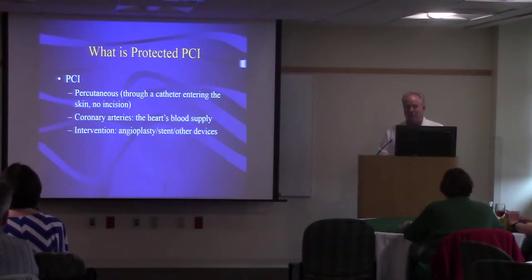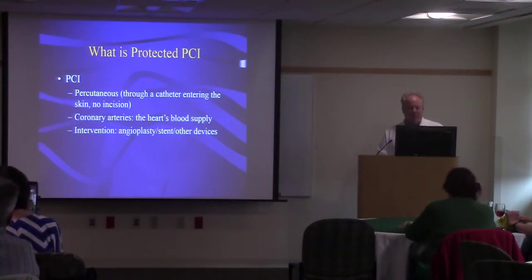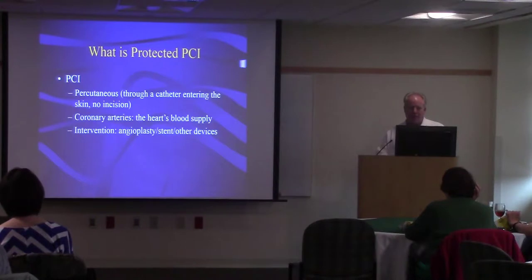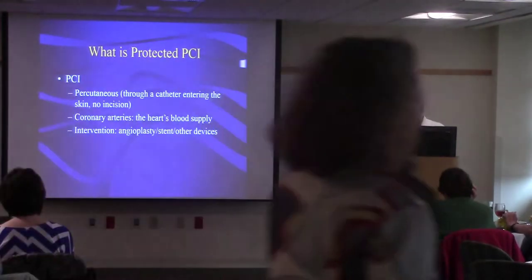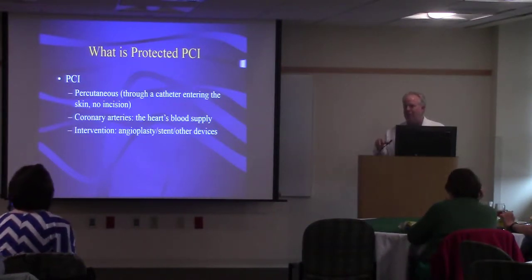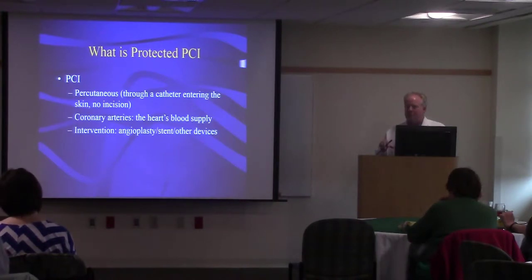The first one is, what is a PCI? PCI stands for percutaneous, which means we go through the skin. It doesn't involve surgery. It's a minimally invasive procedure. It usually involves a catheter, which is inserted like an IV, into an artery or a vein. We work on the coronary arteries, which are arteries that run down the surface of the heart, and they supply the heart with blood. So it's the heart's own blood supply.